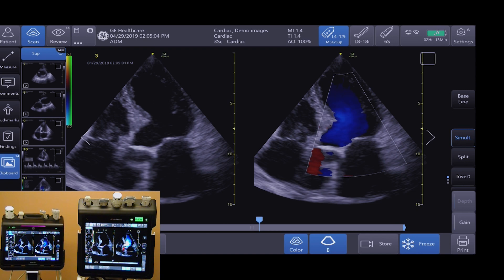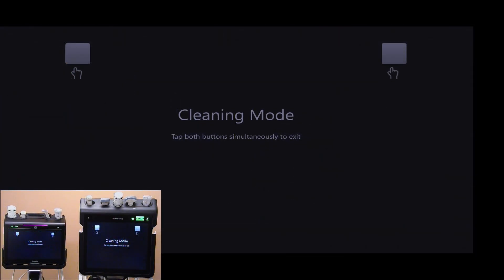The battery life for the Venue is up to 4 hours of scanning time, while the VenueGo is up to 2 hours of scanning time. Each system has an indicator that clearly displays the remaining scan time. Each system was also engineered with a seamless flat display for easy cleaning capabilities.